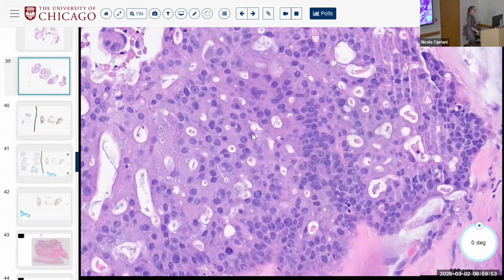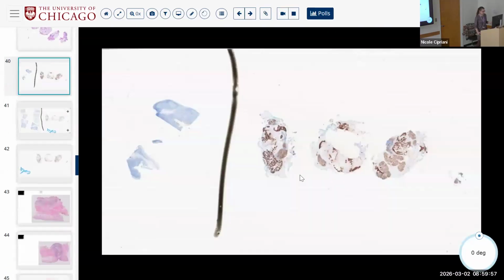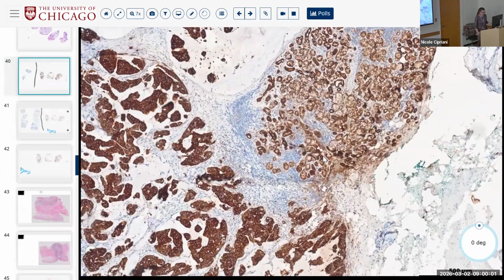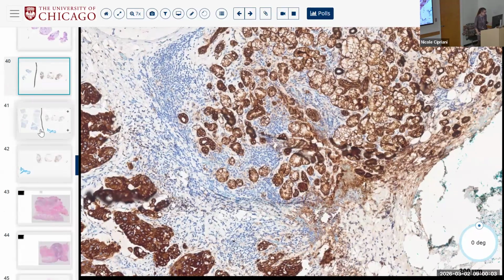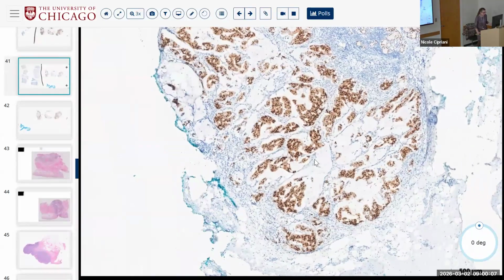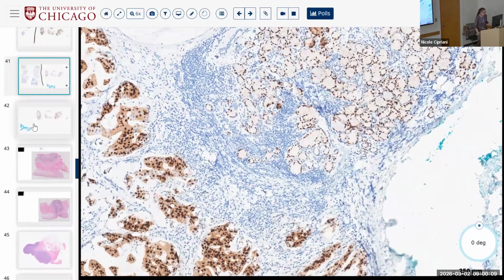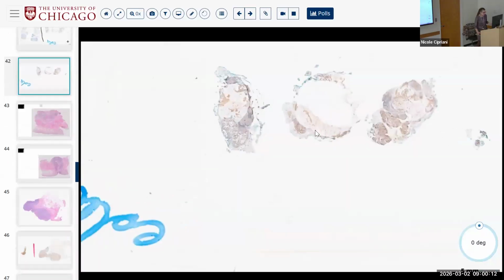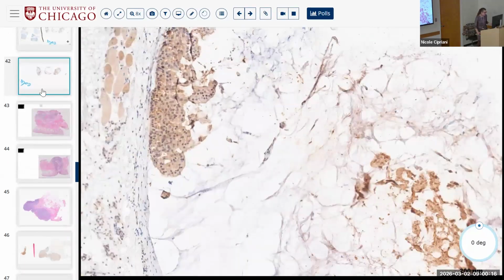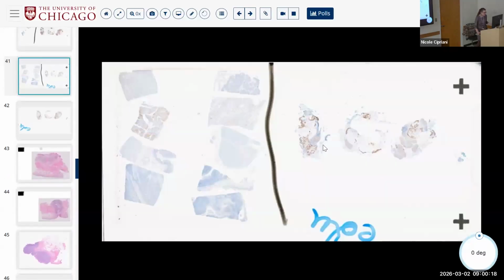The interesting thing about mucinous adenocarcinoma is that I want to find the right thing here for you guys. I don't want to take you astray. I think that's just a keratin. That might be a SOX. No, this isn't.